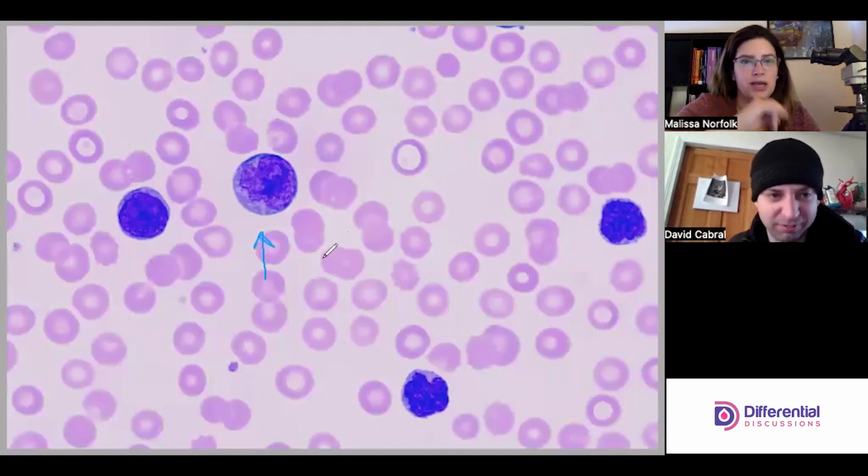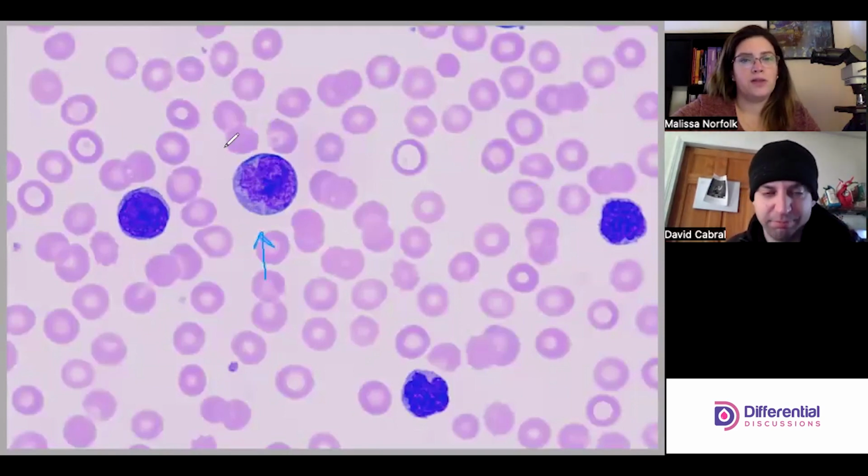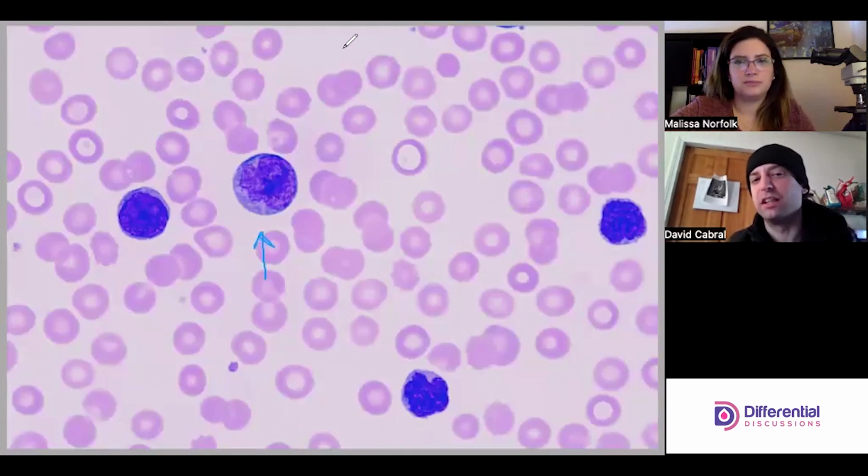Right, absolutely not. The cytoplasm and also the nucleus don't say mono. The cytoplasm, I feel like, is a little bit blue, but it matches that pro-lymph we just saw, and it's starting to look like the lymphocytic cytoplasm. And the nucleus doesn't look mono-y because of this big dark area of heterochromatin. 100% agree. That's too much clumping for a monocyte. I would expect to see a little more cytoplasm in a monocyte too. Usually more equal to a 1-to-1 than this; this is a big nucleus.